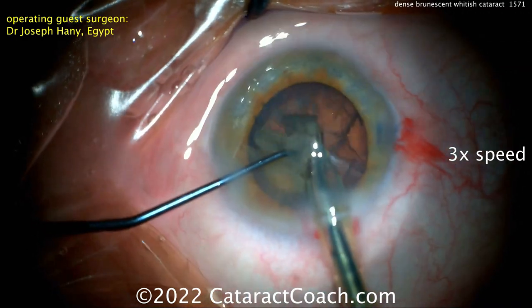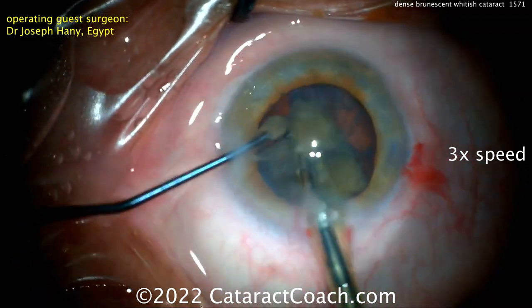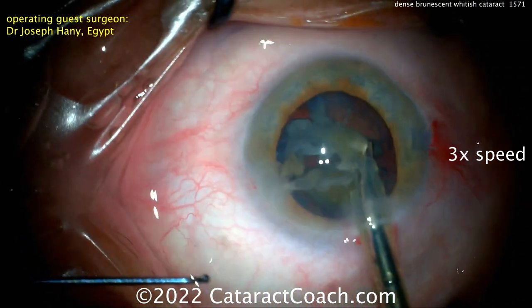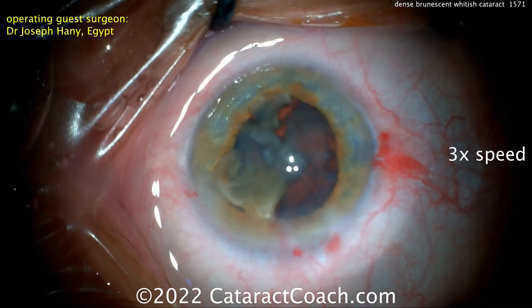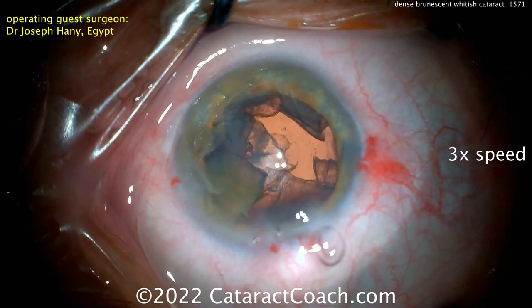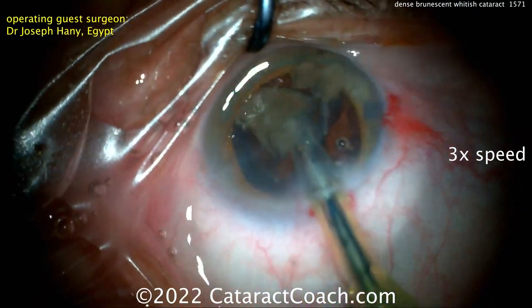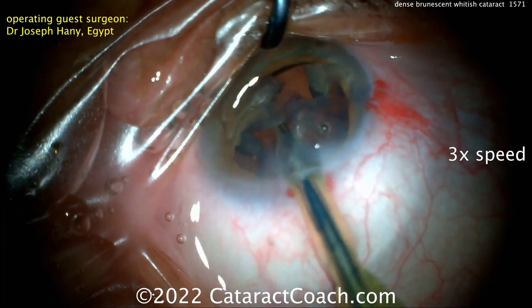Very nicely done. Only a quarter of the nucleus remains in the capsule bag. Be careful with this last piece — keep that chopper in the safe position as the smallest piece comes up. Some surgeons like to remove the second instrument from the eye at this point to prevent egress of fluid out of the paracentesis incision, which helps with fluidic balance. A recoat here — great job, doctor.